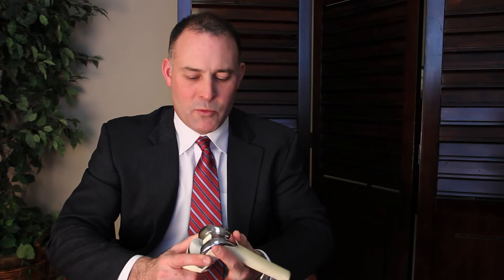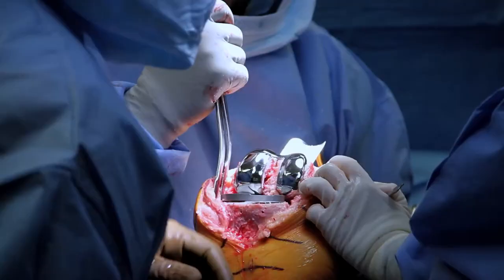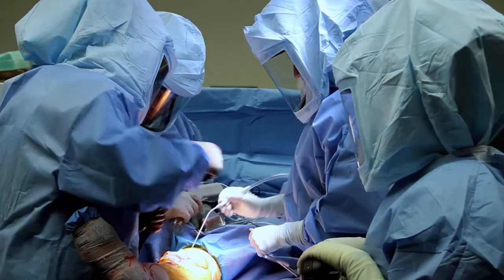Knee replacement surgery actually should be called knee resurfacing surgery. What's really done in a knee replacement is all of the articular surface is removed and replaced by an artificial or synthetic surface, which doesn't hurt when you bear weight. The combination of a polyethylene liner and a smooth femoral surface results in minimal wear and long-term high success rates.